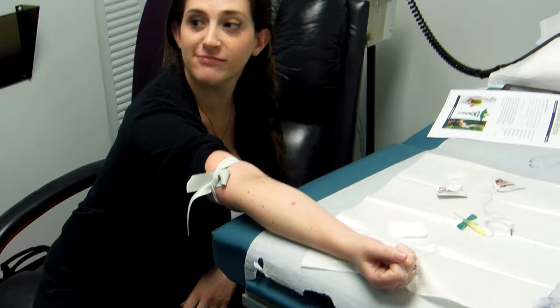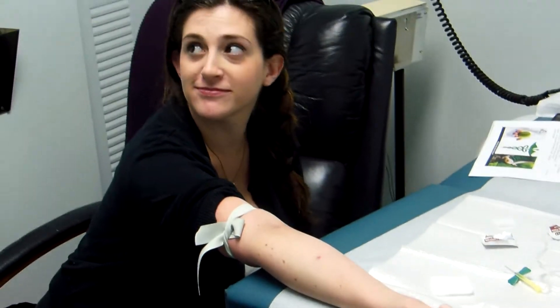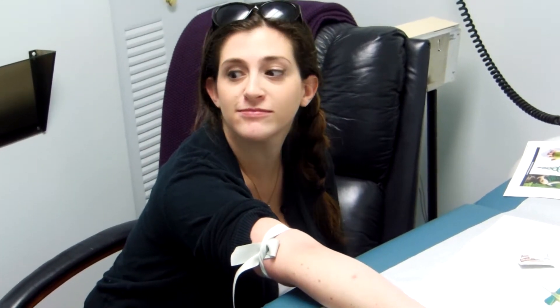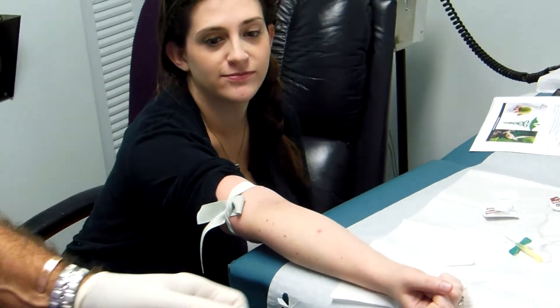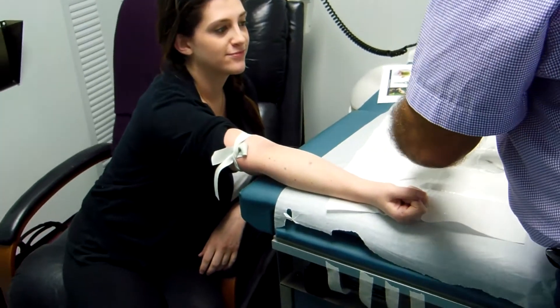I'm actually going to put on some gloves and pop this in. I've got the solution with 0.9% saline with 1 cc of a vitamin B complex mixture in it. We've got everything prepped here and ready.